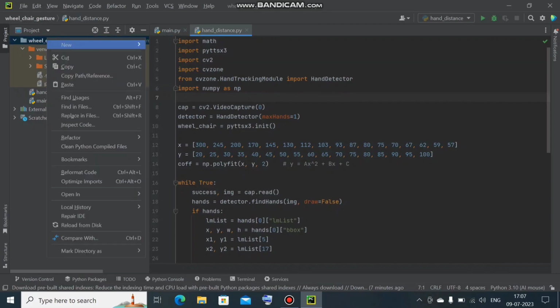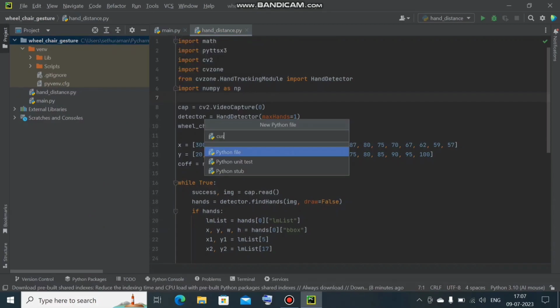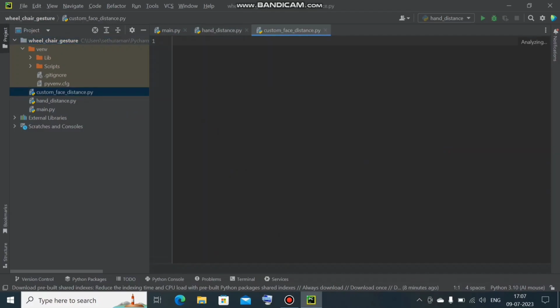Now I'm going to create one new Python file named custom face distance. Press enter. As a first step, we need to get access to our local camera. For that, we need to import cv2. Then we need to assign a variable called cap with VideoCapture.